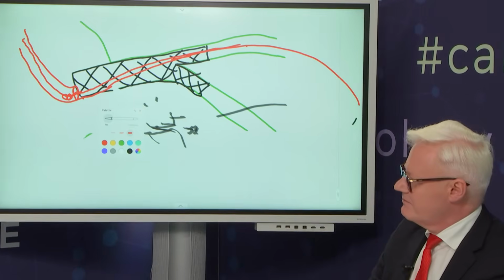If I can summarize while you are starting your slides, the attempt is to push this wire, which is soft but not hydrophilic, to disengage the catheter and have a more favorable position of the catheter, which will allow you to do some fishing and to try with the second wire to get through the lumen, which needs to be confirmed by imaging. Of course. I saw already your nice images. Please share with us. And excellent.